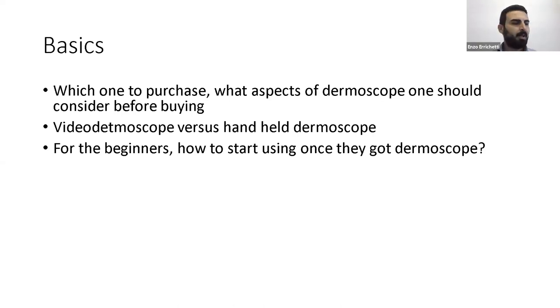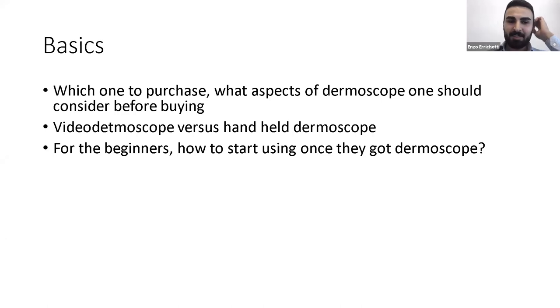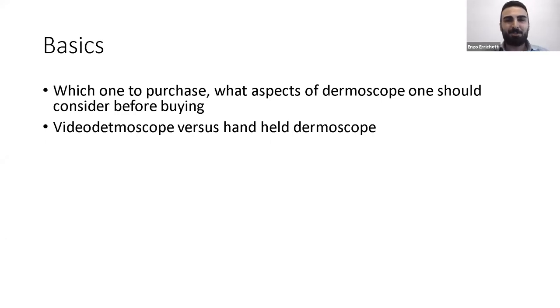Okay. May I say something? Yes, please. I completely agree with Balachandra, but the point is that in clinical practice, a handheld dermoscope is easier to bring, we can take it in the pocket. And I think we can zoom further by linking our mobile with the dermoscope, so we can zoom further into the lesions with our phone. I don't know if you use this setting. I agree with you. Yeah, we can zoom in. Because a video dermatoscope is a little bit big to put in the pocket. And the cost factor is also there.